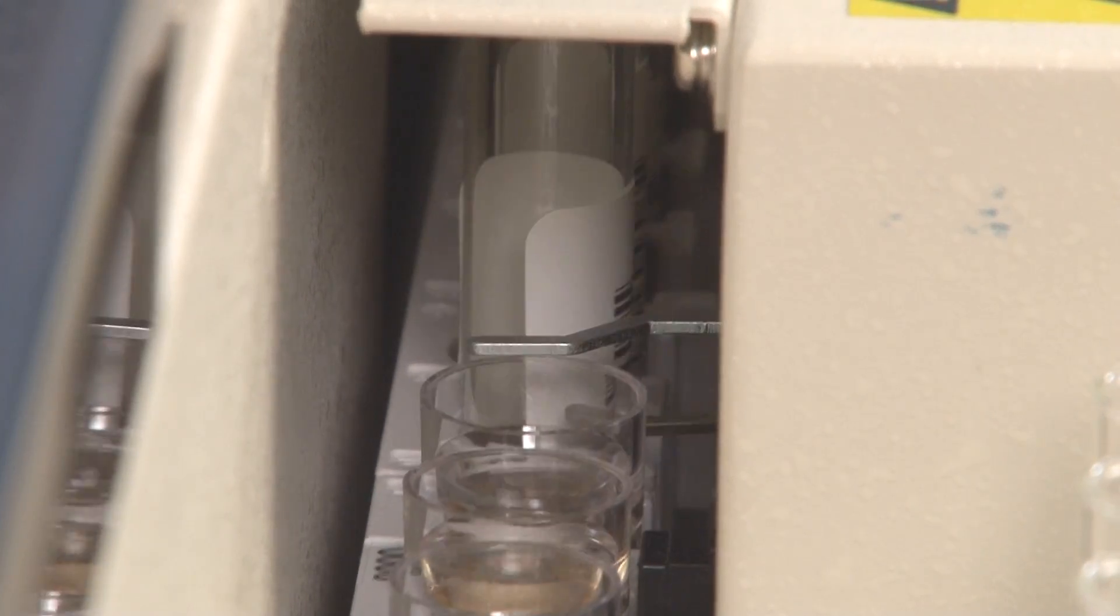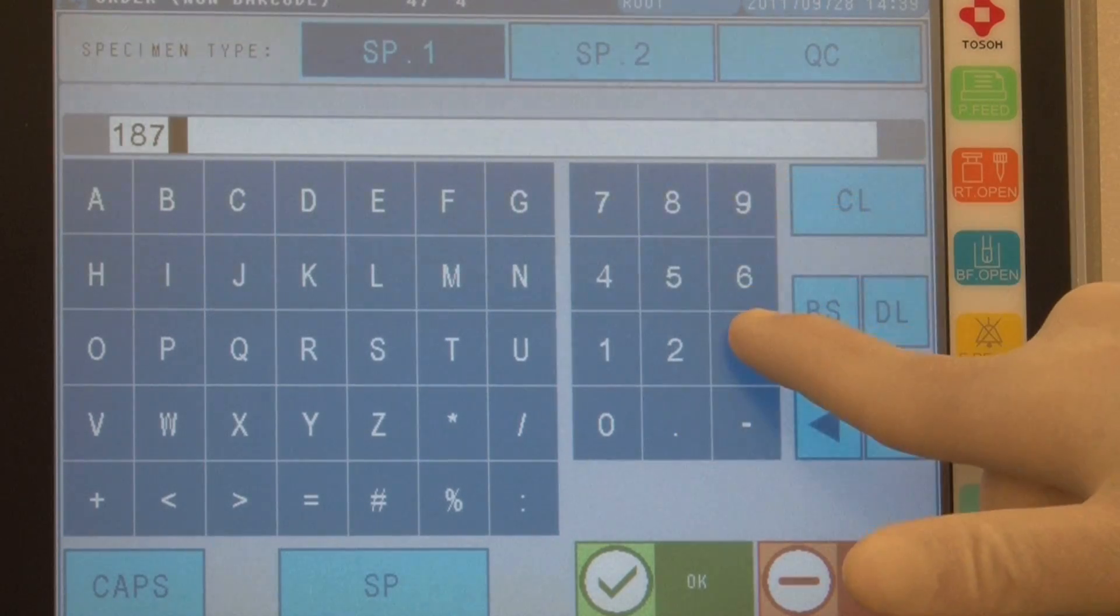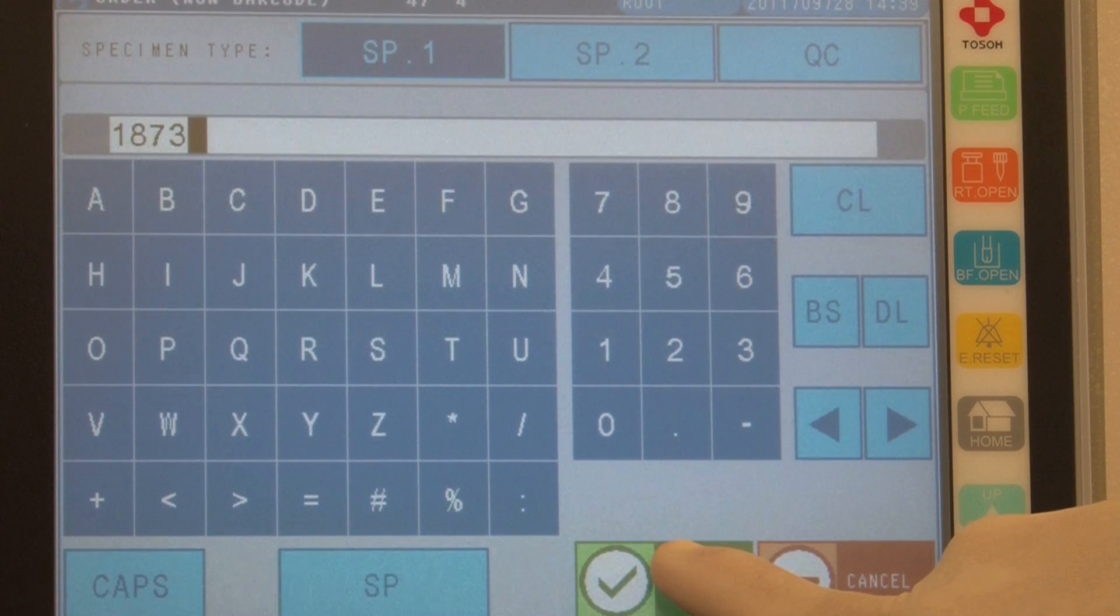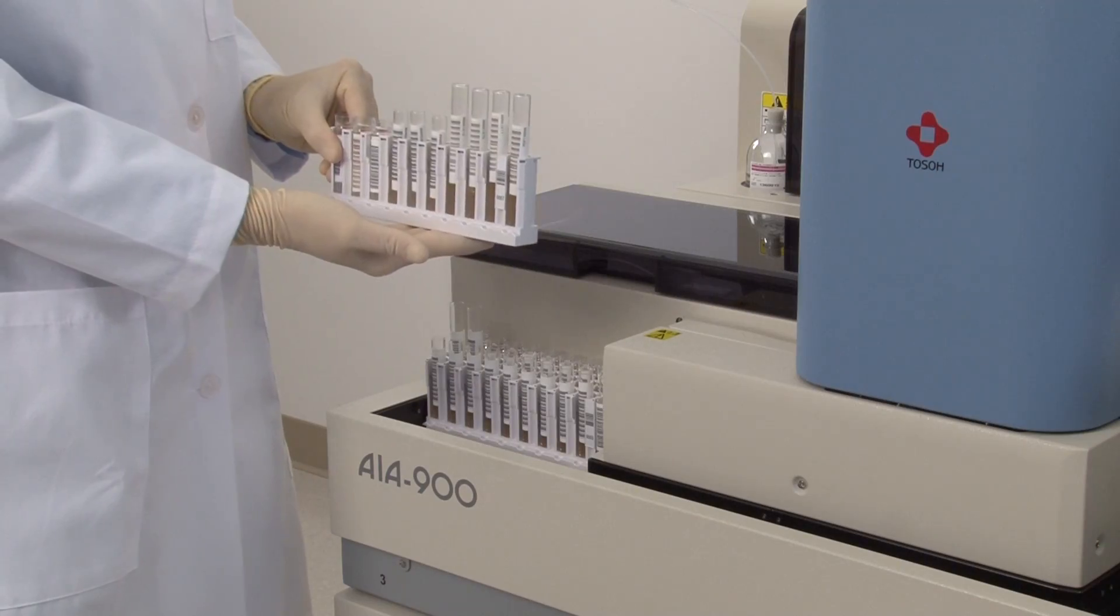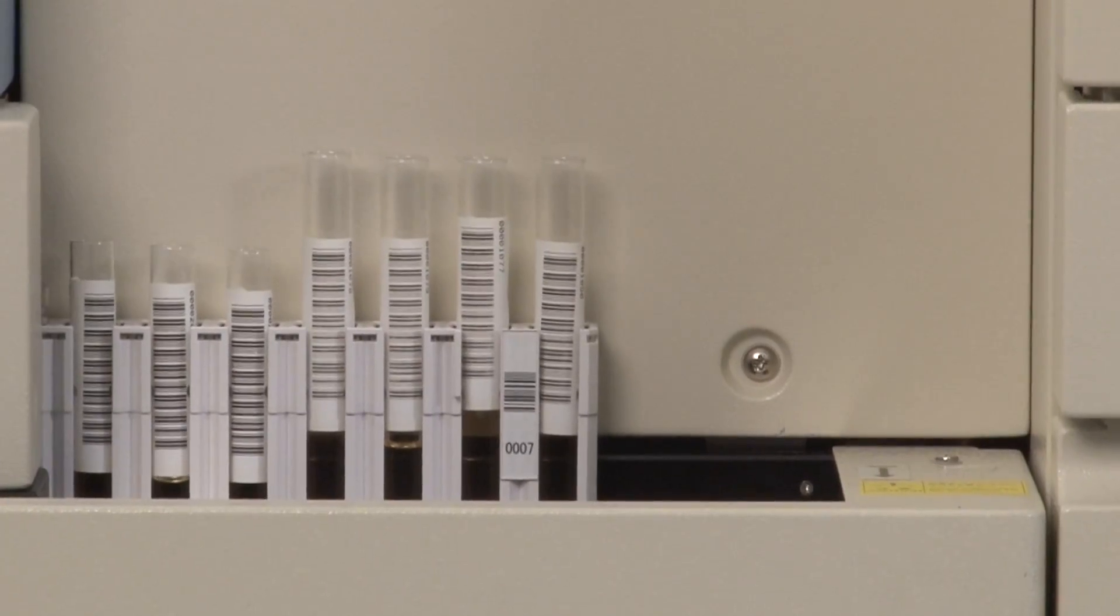For non-barcoded specimens, the operator merely types in the sample ID and the instrument does the rest. With continuous loading and random access operation, additional samples and tests can be added at any time without interrupting sample processing.